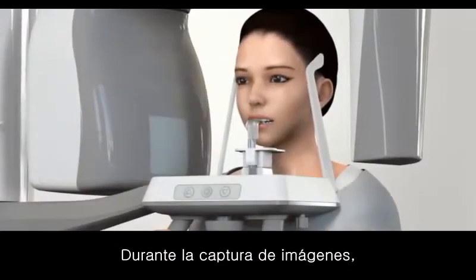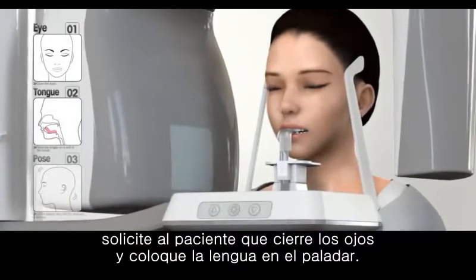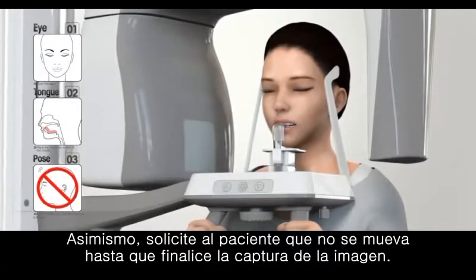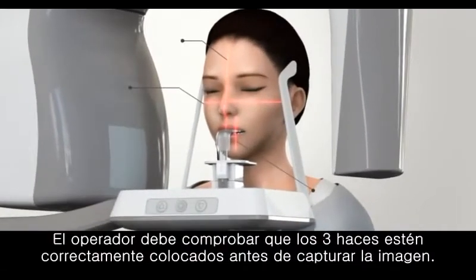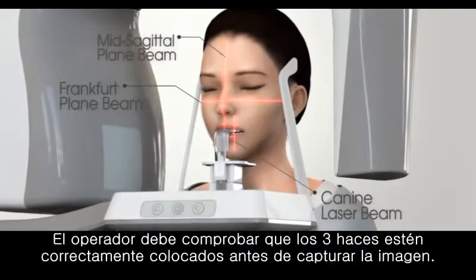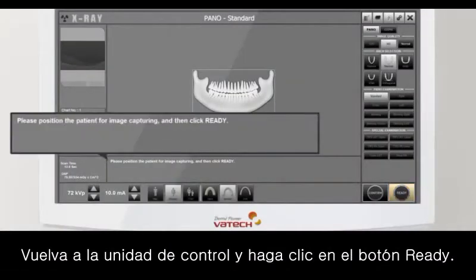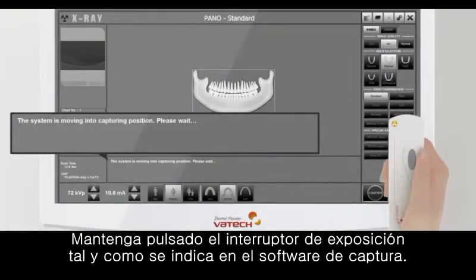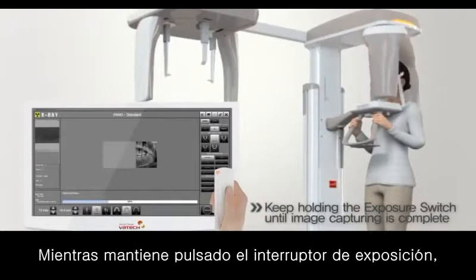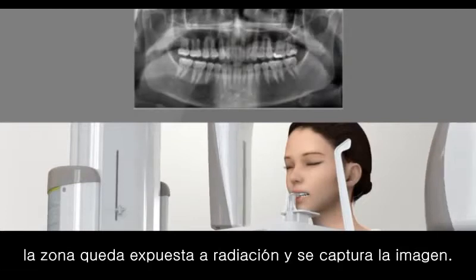During image capturing, ask the patient to close the eyes and place the tongue on the hard palate. Also, instruct the patient not to move until the image capturing is completed. The operator should confirm 3 beams are placed appropriately before capturing the image. Go back to the control unit and click the Ready button. Press and hold the exposure switch as guided in the capture software. While the exposure switch is held, radiation is exposed and the images are taken.